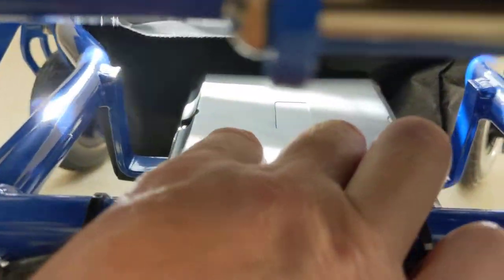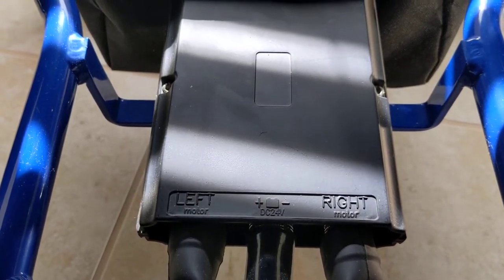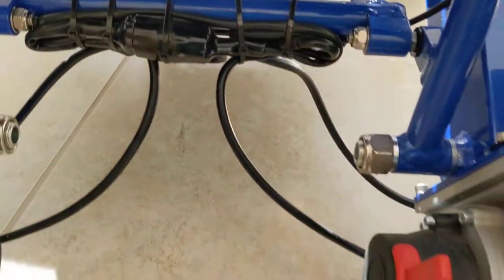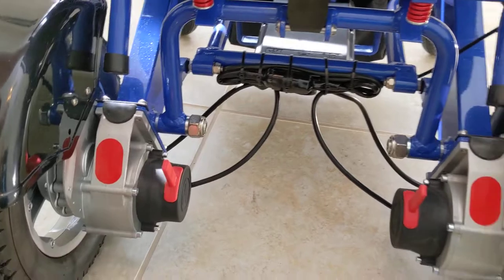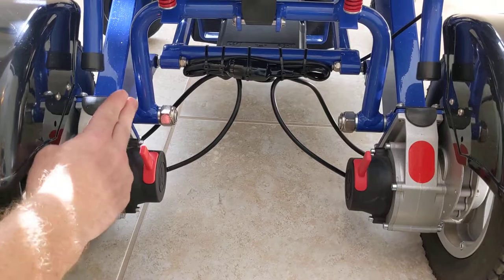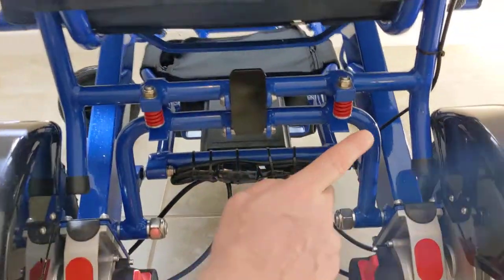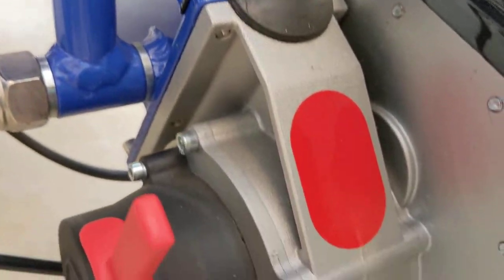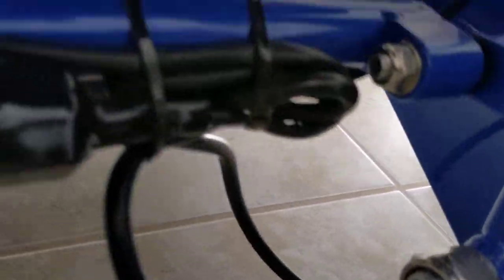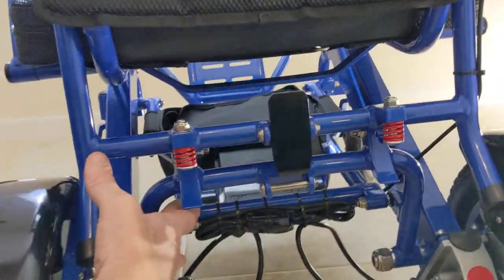Underneath the chair is the CPU unit — essentially the motor control center. It receives commands from the joystick and operates the right and left motors. These are brushless motors, which are virtually maintenance-free. Brushless electromagnetic motors operate in a virtually frictionless environment, whereas brushed motors conduct electricity by making contact with other moving metal pieces, creating friction and more inherent potential for breakdown.